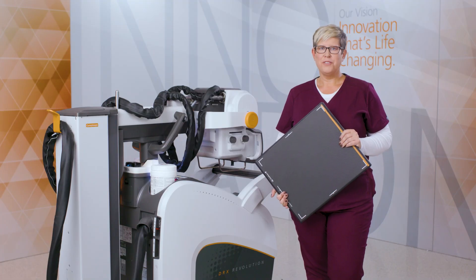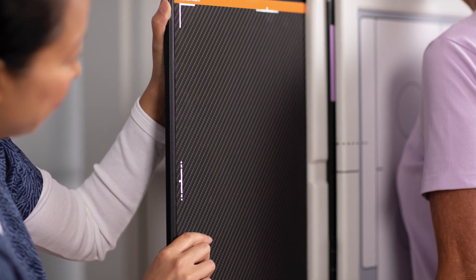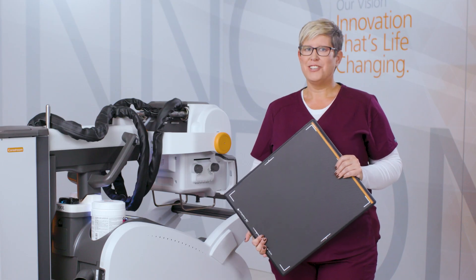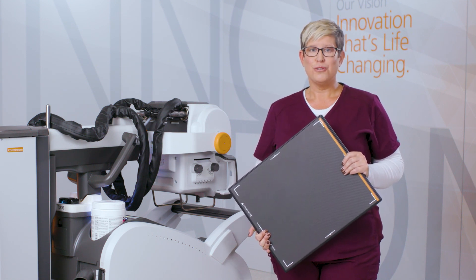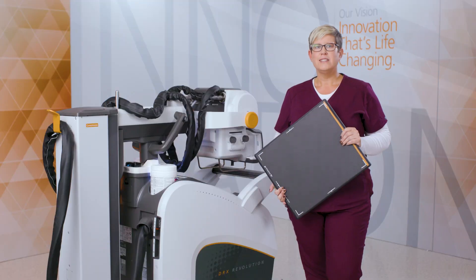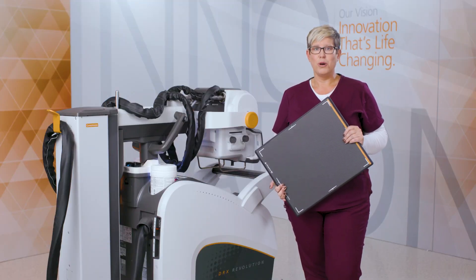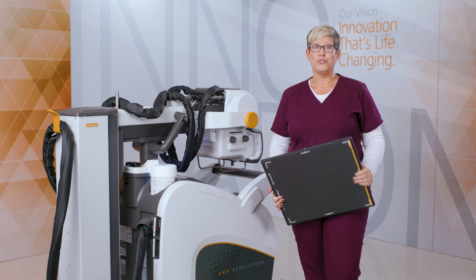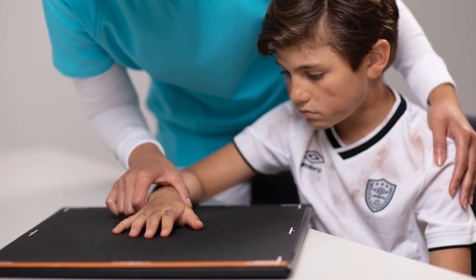The CareStream Luxe 35 detector is our newest innovation in detectors for the medical market. This breakthrough detector has a sleek new design and is our first non-glass detector, resulting in a lighter weight compared to DRX+. Design improvements make this the ideal detector to use with your mobile x-ray system to reduce stress and complexity for radiographers, while maximizing comfort and care for patients.